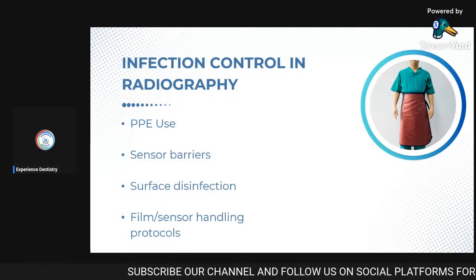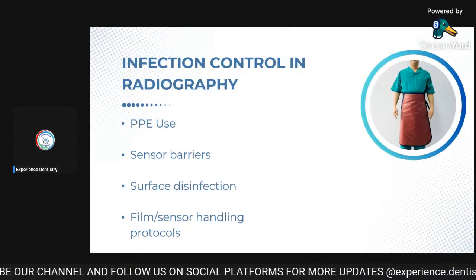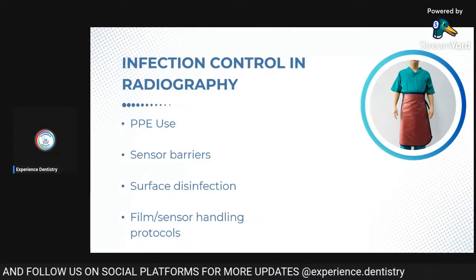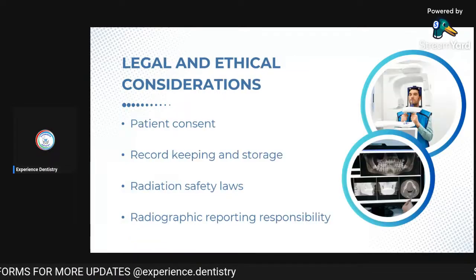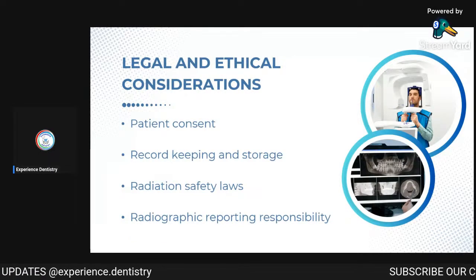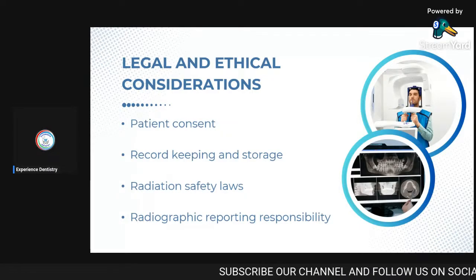You have to wear PPE yourself, and you also have to make sure that your patient wears a thyroid collar and the lead apron as well, so that he does not get the harmful effects of it. So basically, what are the legal and ethical considerations regarding it?